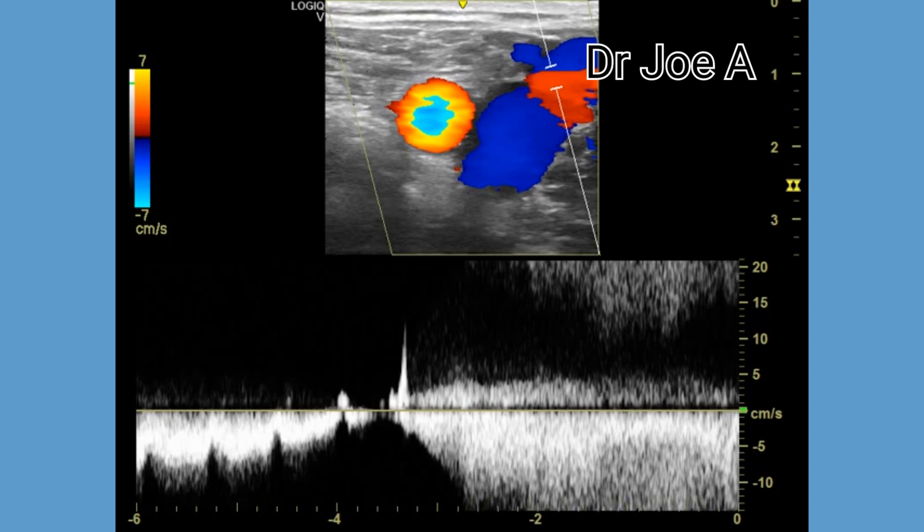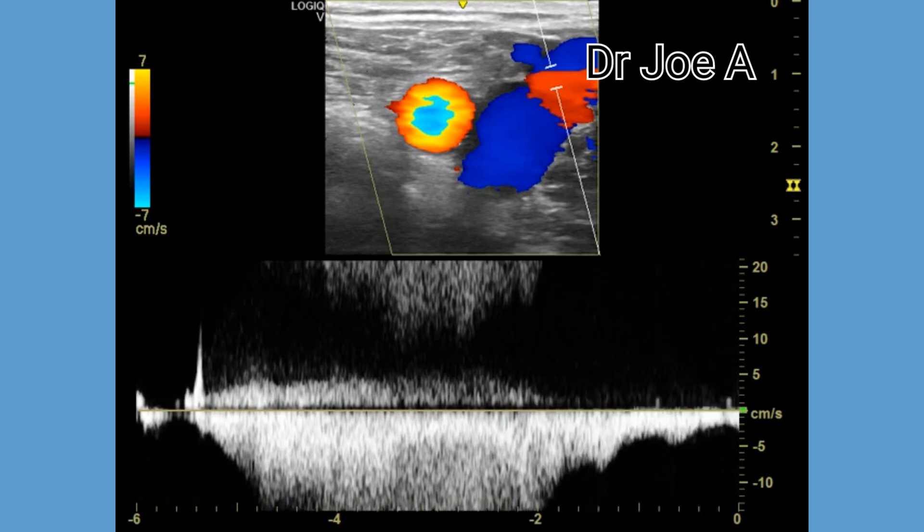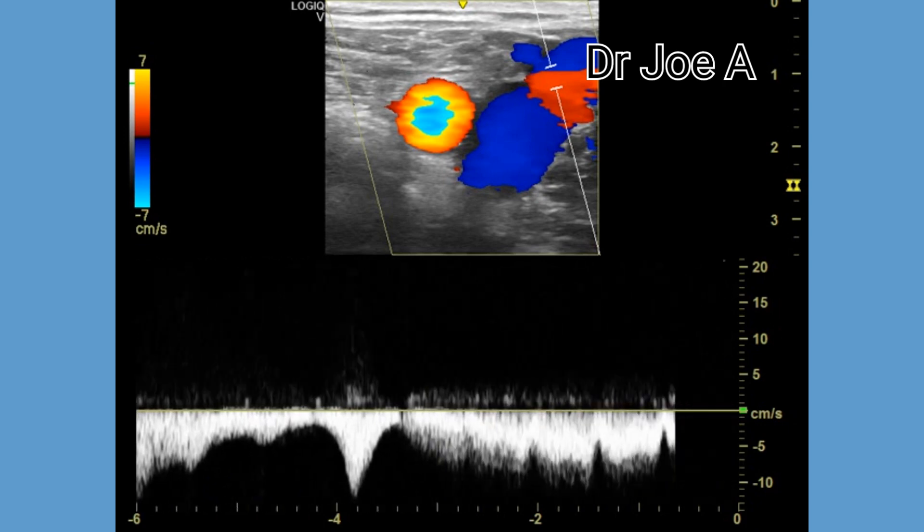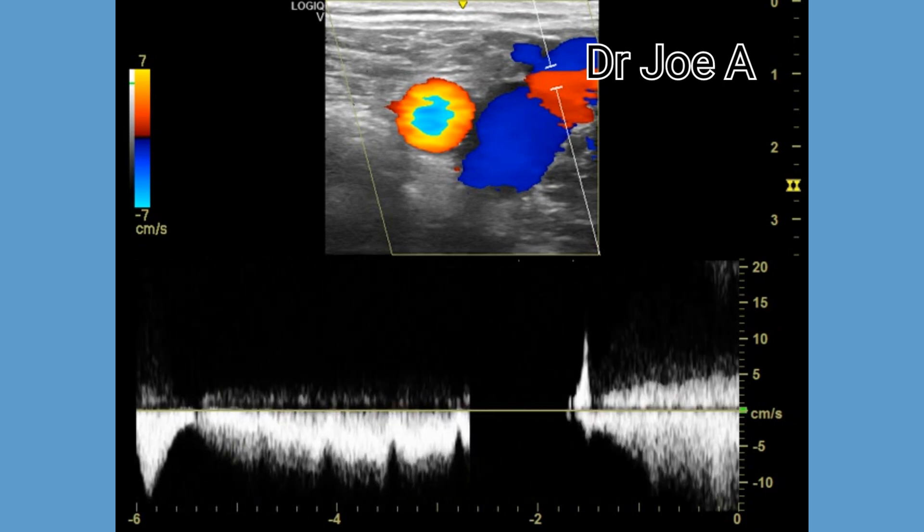Therefore, it is important to accurately diagnose and assess the severity of saphenofemoral junction incompetence using color and spectral Doppler ultrasound.